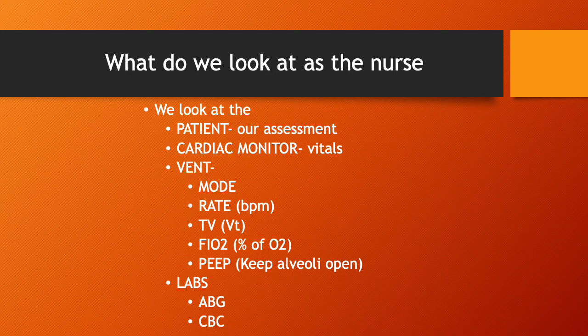And we're going to kind of break that down. Then I look at what rate they are on, how many breaths per minute, how much tidal volume they are on? And we're going to go through each of these. So don't worry if you're like, oh God, I'm already lost. We're going to look at each of these. We also want to know how much FiO2 or oxygenation they're on, and then how much PEEP. And PEEP is another way that we manage their oxygenation.